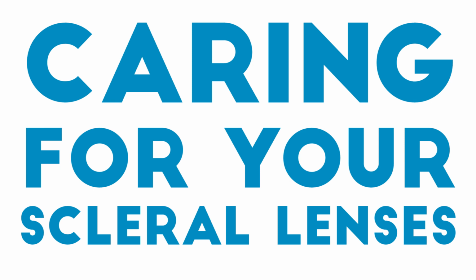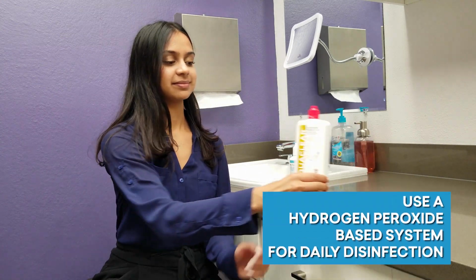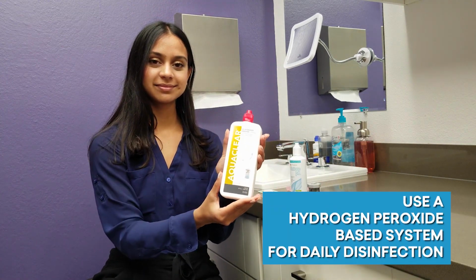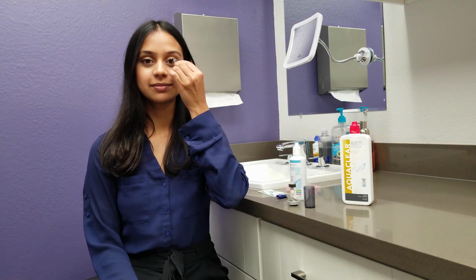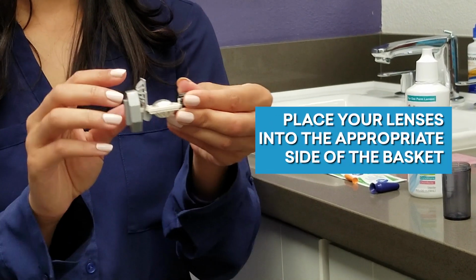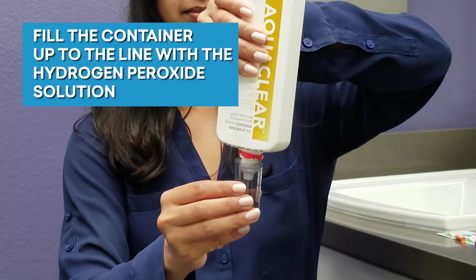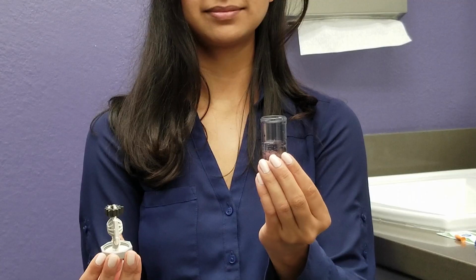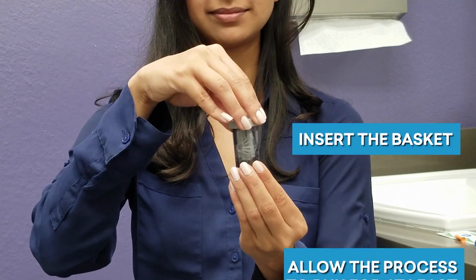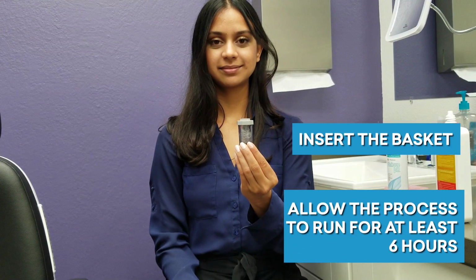Caring for your scleral lenses. This is the regimen we recommend at our office. For daily disinfection, we recommend using a hydrogen peroxide-based system. After removing your scleral lenses, place them into the appropriate side of the basket. Fill the container up to the line with the hydrogen peroxide solution, and then insert the basket and allow the disinfection process to run for a minimum of 6 hours.